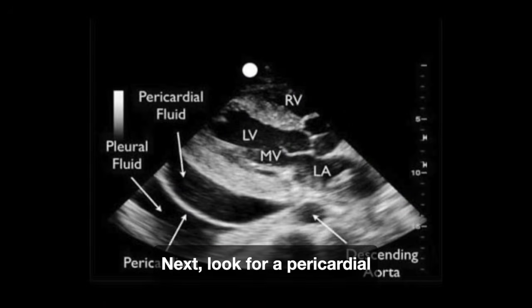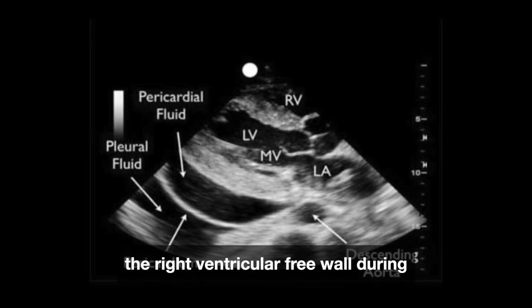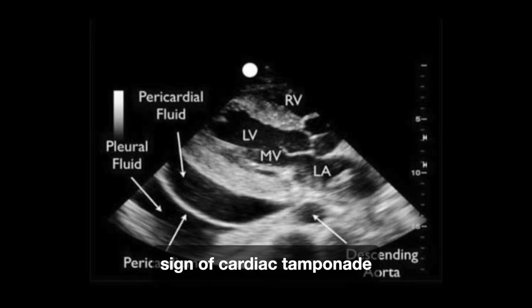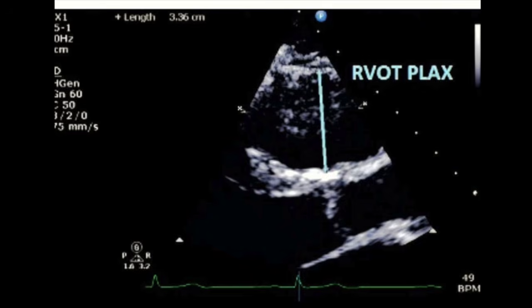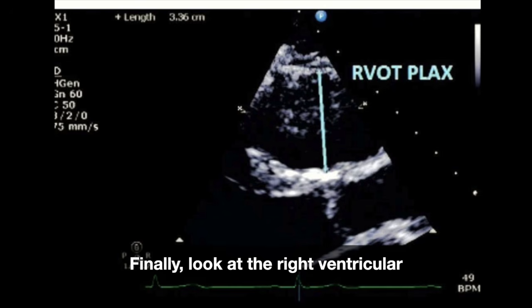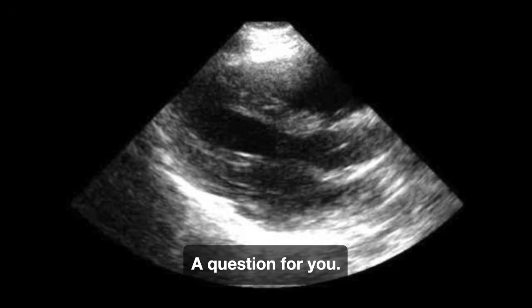Next, look for a pericardial effusion and right ventricular collapse. When an effusion is present, observe the right ventricular free wall during early diastole. Diastolic collapse is an important sign of cardiac tamponade and appears before hypotension develops. Finally, look at the right ventricular outflow tract at the top of the image. If it appears enlarged relative to the left ventricle, that should prompt a detailed assessment of the right heart in the other echocardiographic views.